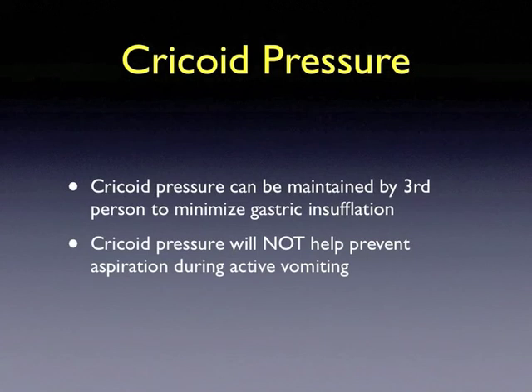If you have extra hands, cricoid pressure can be maintained by yet a third provider to minimize gastric insufflation, but you want to reinforce the point that cricoid pressure isn't going to help prevent aspiration during active vomiting.